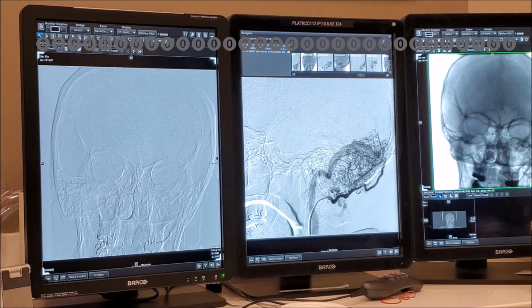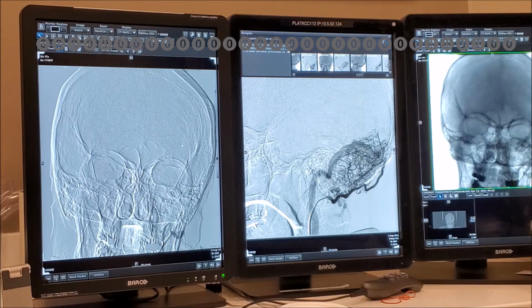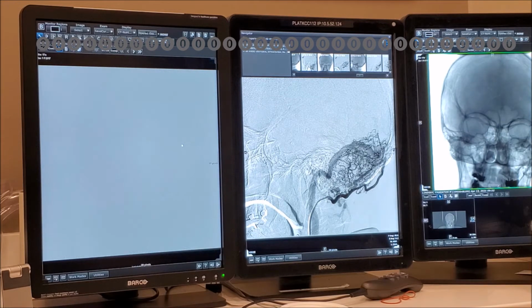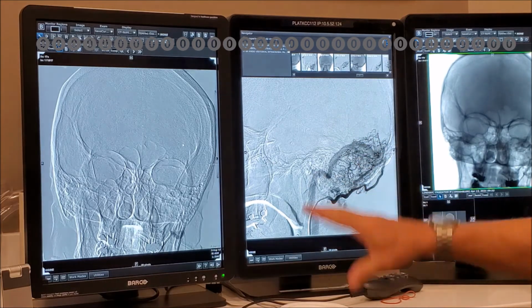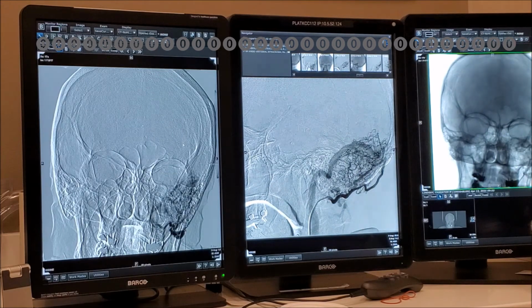Maybe. That's okay. So this is very nice because it shows you what we were asking, right? Now, what you can do too in a case like this, look what happened. The mask that was obtained here was in one period of the respiration of this individual. So this is a very good mask, but it's not the contrast because he's moving already. It's moving, you see? So what you can do in the screen, in the machine, is make this the mask, and then you will get a very good picture, okay? Because here this is useless, but you get this information, right?